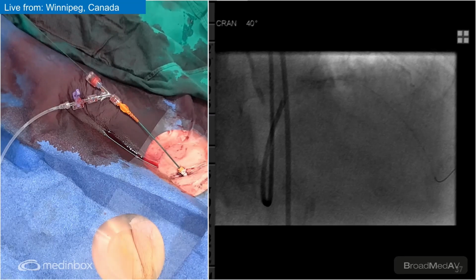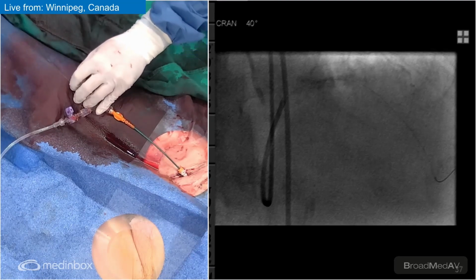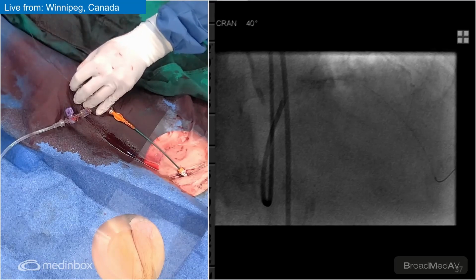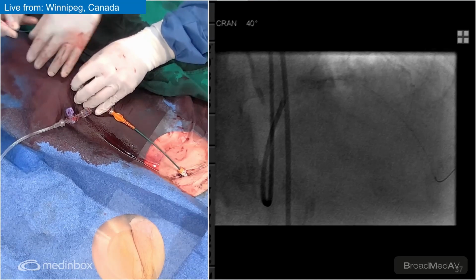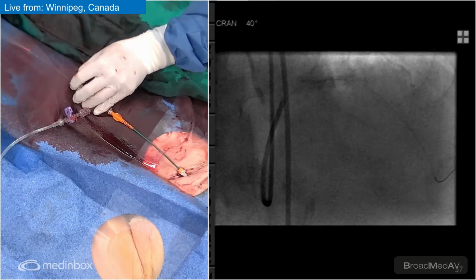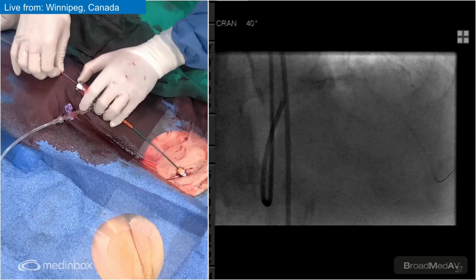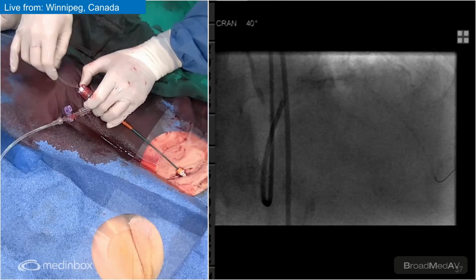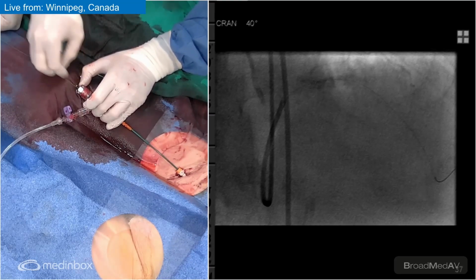Do you want the guideline or? We got it last time. Let's see. Hopefully with the stent in, we change the morphology of that ostium. There we go. Be interesting to know what other labs use to displace blood as opposed to contrast. Historically we've used contrast. There's other options obviously out there. Saline typically doesn't do the job well enough. You can look. I got it. There you go, Jim.